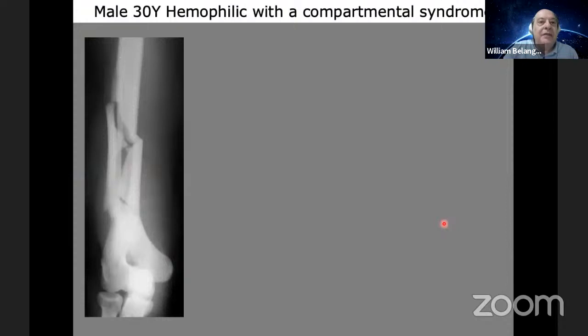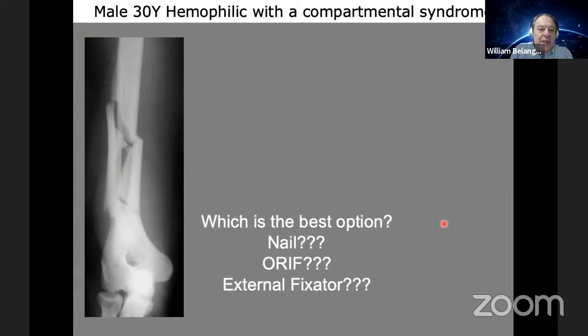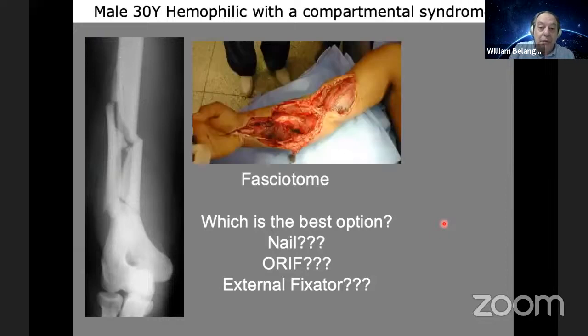This is a very interesting case. Let me show you. This is a male hemophilic patient with a compartmental syndrome. This is a very complex distal fracture. Which is the best option for this patient? Nail: I think it's very difficult to fix the nail in the distal part of the humerus. Open reduction in a hemophilic patient with a compartmental syndrome, external fixator, or MIPO.